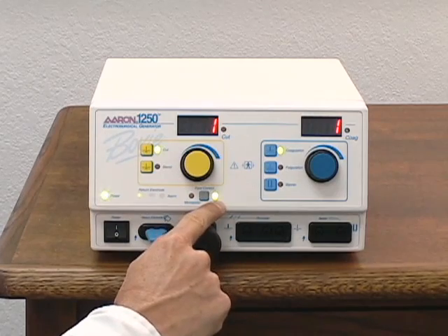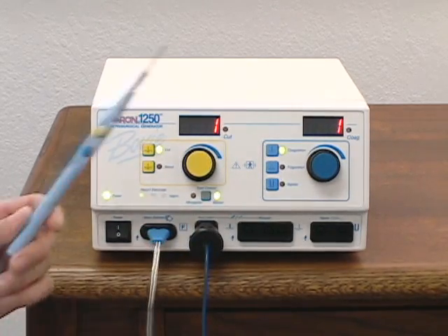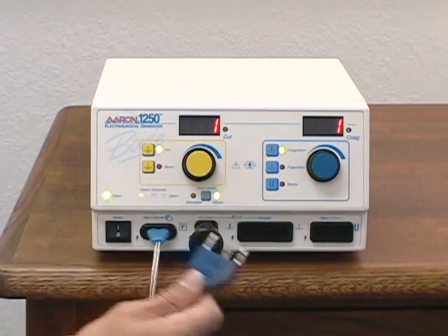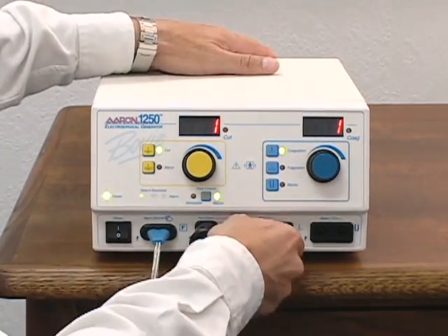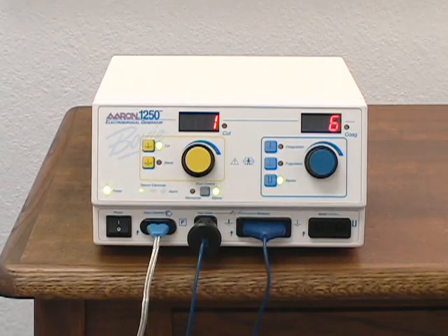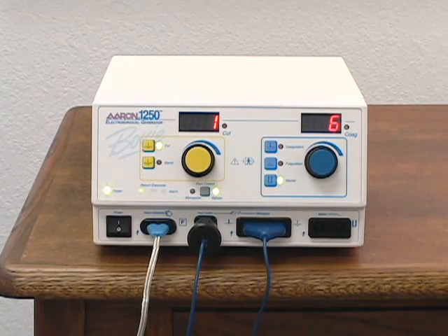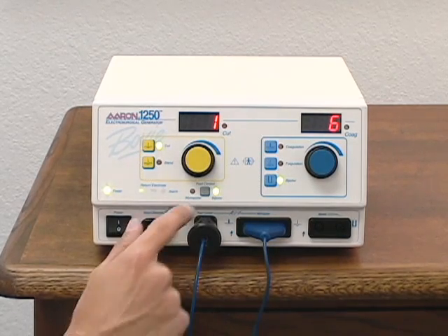Only the mode that is selected will be available for activation. To attach a monopolar pencil, insert the plug into the receptacle marked monopolar. To use optional bipolar forceps, select the bipolar mode. You will notice the foot control indicator switches to bipolar. This indicator must be switched back to monopolar in order to activate a monopolar foot control accessory.